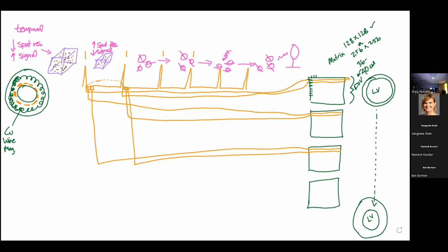So is somebody going to be able to hold their breath for 2 minutes? Meh, that's not going to work. So how do we deal with that? So when you guys are doing these scans now, you hear the machine going, breathe in, breathe out, hold your breath out. That's really hard to hold your breath out, I think, if you're kind of struggling for air. Try that sometime, even if it's for 8 seconds. A lot of times, what you want to do when you do that breath holding coaching is just get something that's going to be comfortable for the patient.